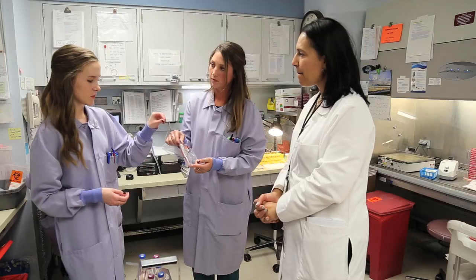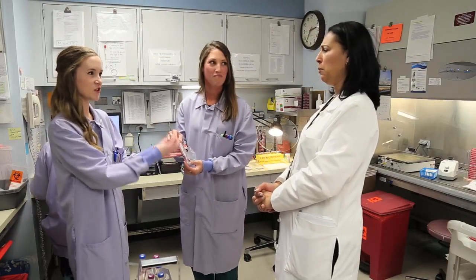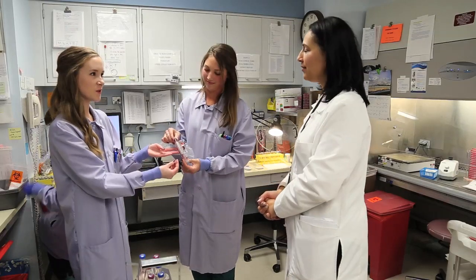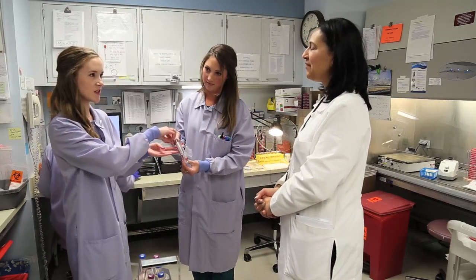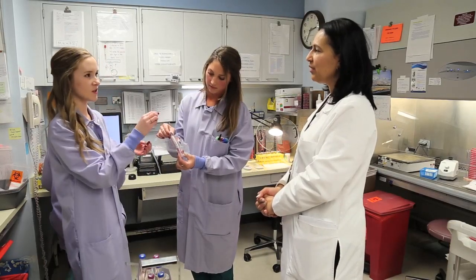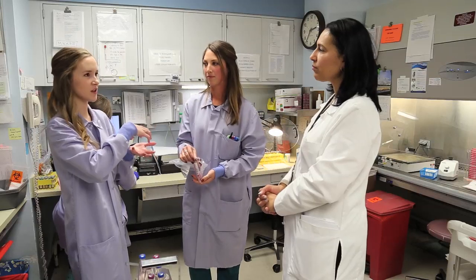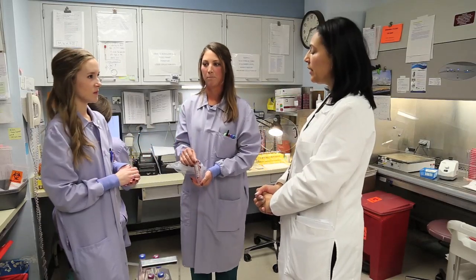I don't think it's acceptable, but sometimes people will put fluid into this tube as a transport, for fluid or for tissue. I've seen tissue jammed into the gel. The opening for this tube is very small, and it's borderline impossible to get it up and out of the gel. Just put it in a sterile cup.